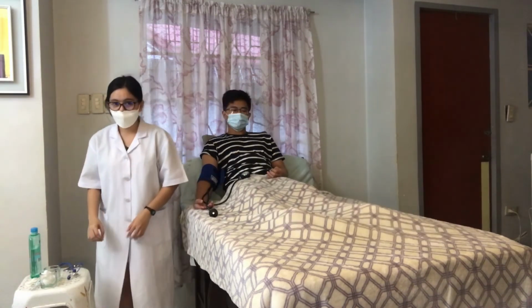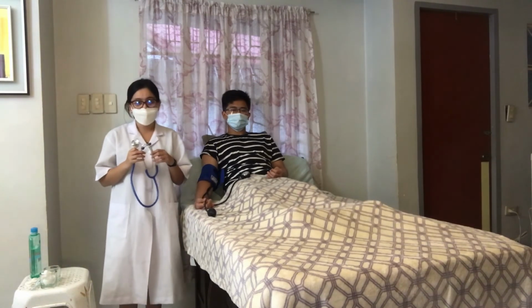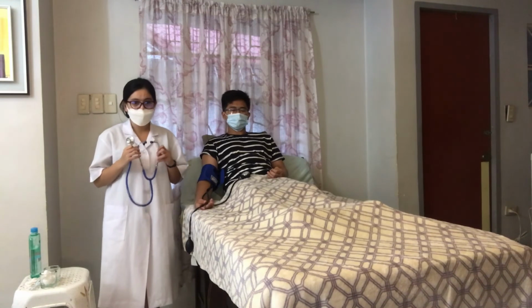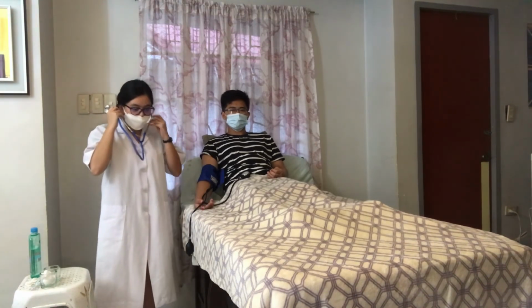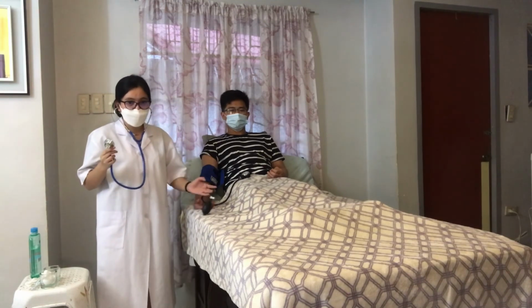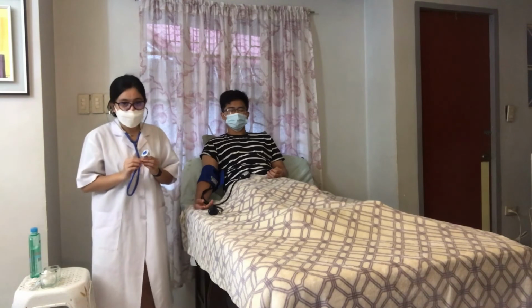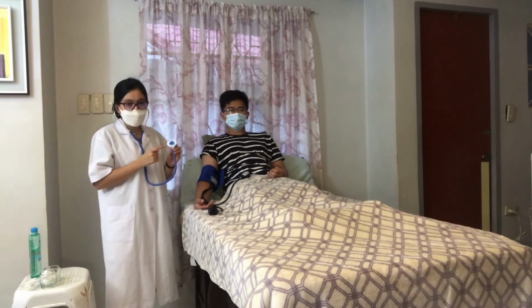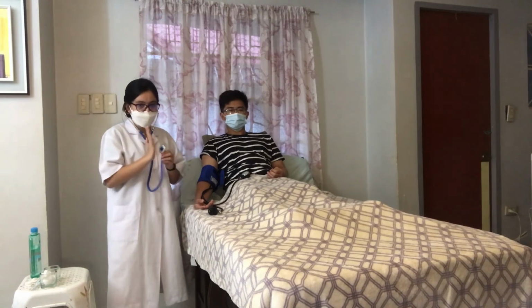So now we are going to insert the earpieces of the stethoscope in the ears so that they tilt slightly forward. We must make sure that the sounds are clear and not muffled. We must also ensure that the stethoscope hangs freely and is not in contact with any object. So we must warm the diaphragm of the stethoscope by using our palm.